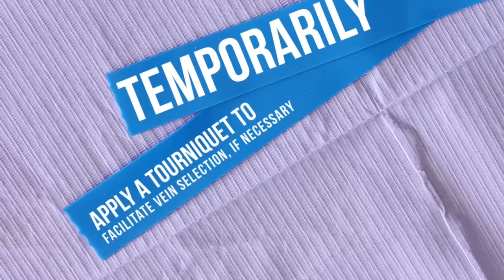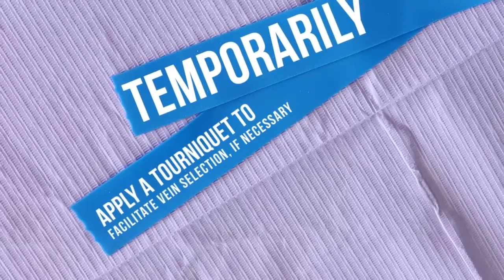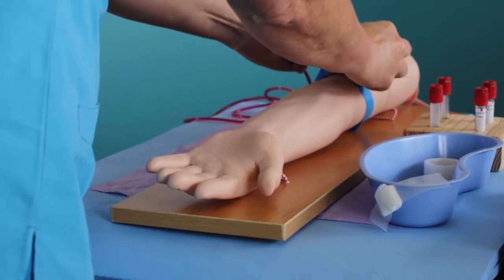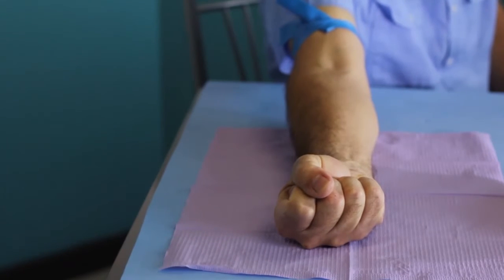Temporarily apply a tourniquet to facilitate vein selection if necessary. When ready to draw the blood, apply the tourniquet about 4 to 5 finger widths above the selected venipuncture site. Ask the patient to form a fist to make the veins more prominent.